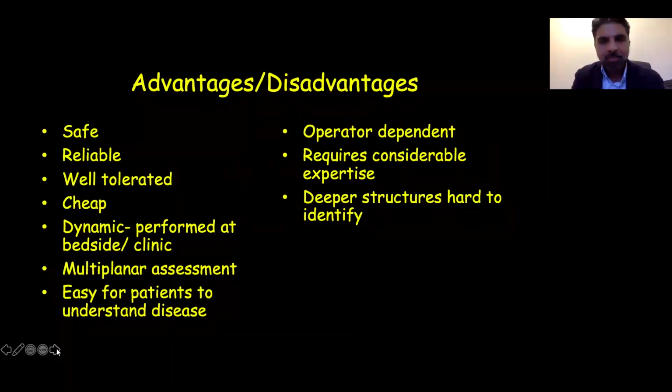So what are the advantages and disadvantages of ultrasound? Well, it's pretty much the same as any other modality or any other condition that we use ultrasound in. We know it's safe, we know it's reliable, we know it's well tolerated, and it's very cheap. It's also dynamic and can be performed at the bedside, and it allows a multiplanar assessment.